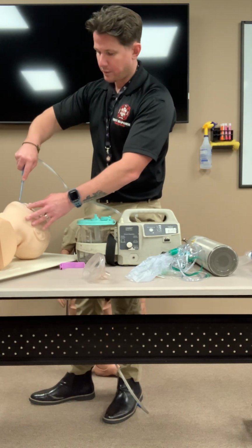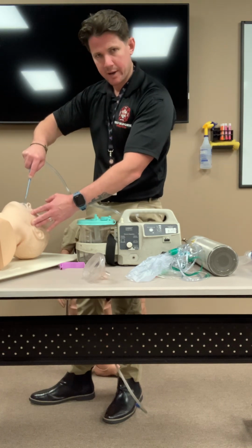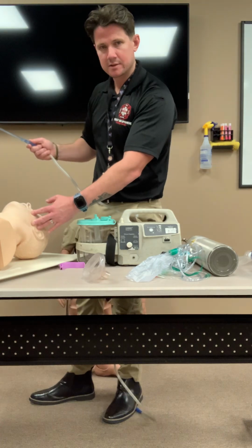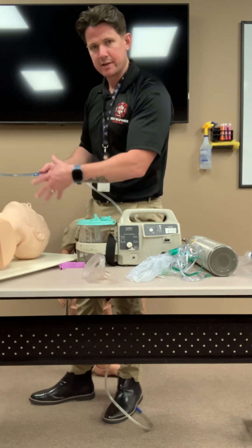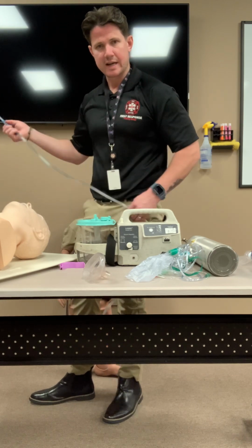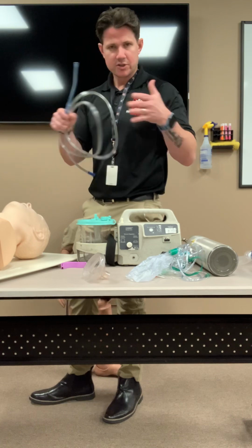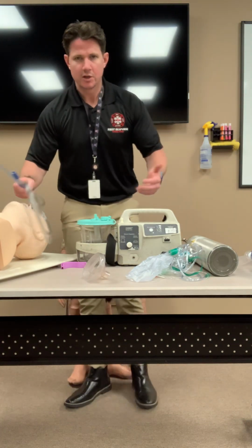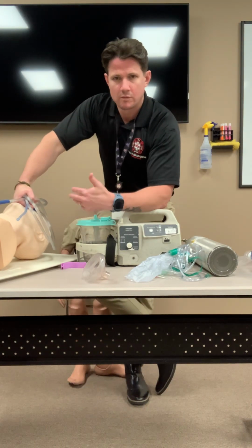And when we pull it out, we want to suction in a circular motion to try to cover as much surface area of the airway as possible, right? And we do this for no longer than 15 seconds. Once you've cleared the airway, you're going to go back to bagging for 2 minutes and then assess for more secretions after the fact, okay? So that's your suction scenario, if you have to suction as part of your BVM skills station, right?